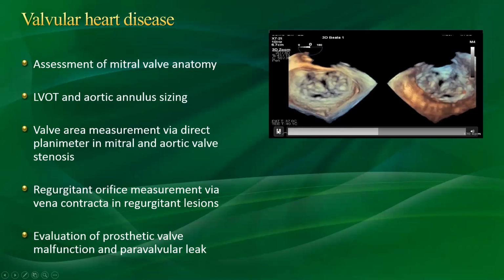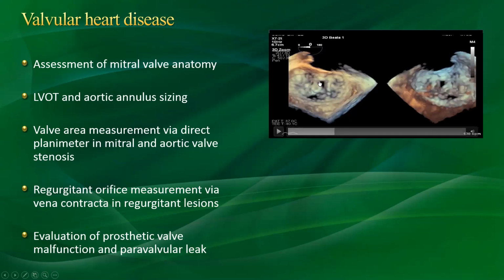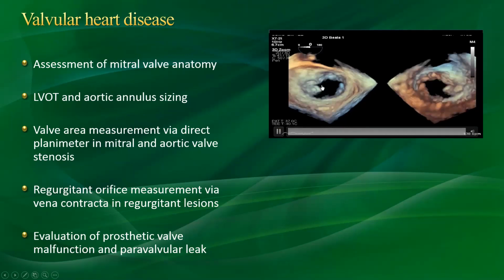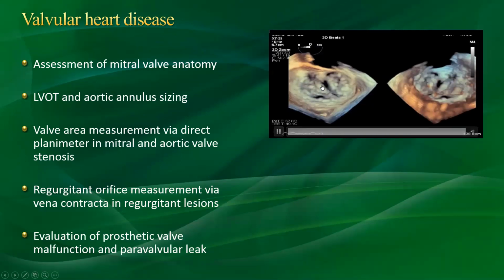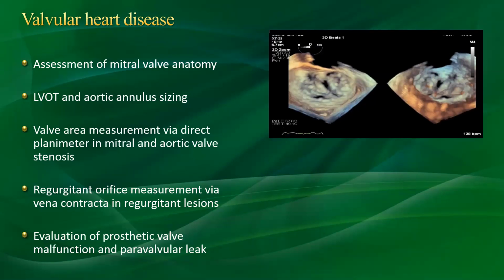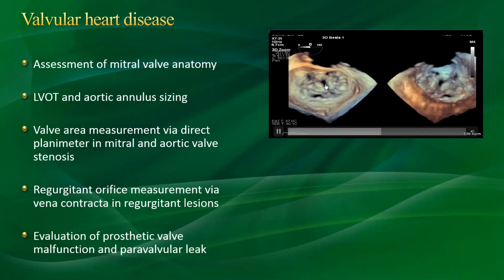So you can see here in this patient, there is a cleft at the anterior mitral valve leaflet that is very difficult, even for an expert cardiologist and imager, to diagnose with 2D echocardiography. And 3D allows us to pick up more of these cases that come with moderate to severe MR. When you do your transthoracic and transesophageal, you can't pinpoint a certain defect, but with one single 3D zoom image, for example in this case, you can easily appreciate this defect, the cleft in the mitral leaflet.